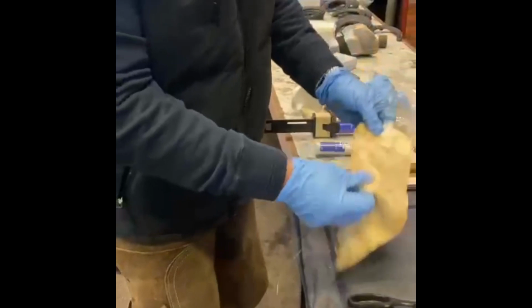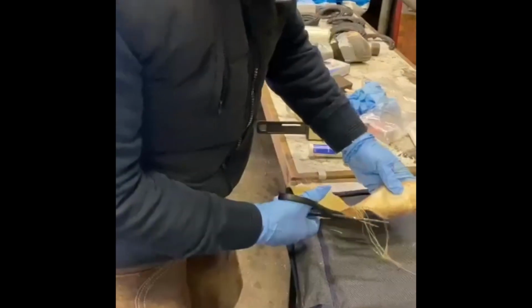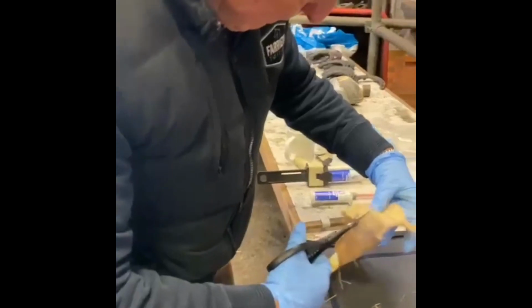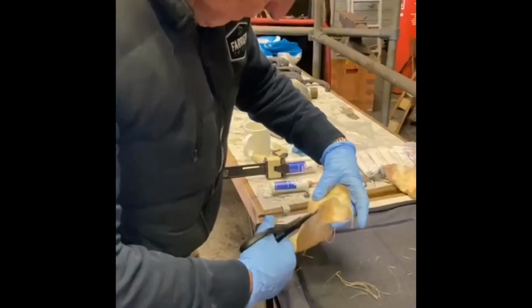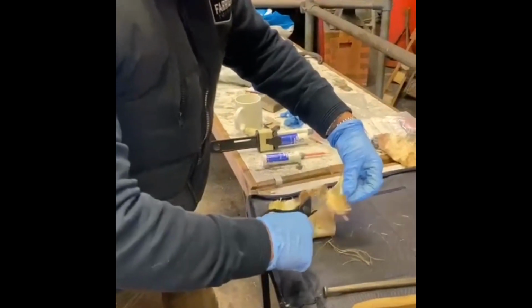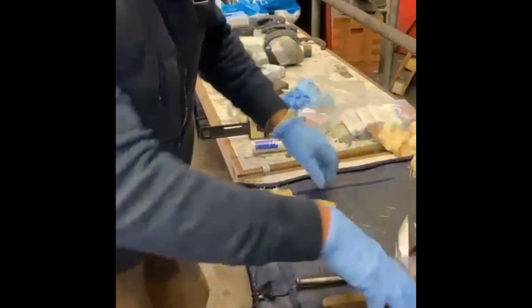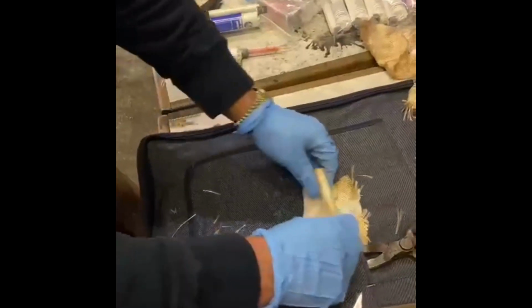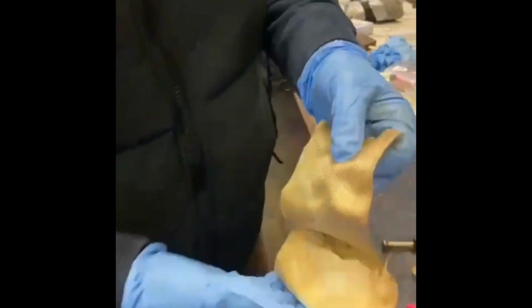So try it on the coronary band, wrap. Yeah, way too big. So I'm going to reduce it. Always easier to reduce it than to make it bigger. Obviously we shorten the length. Get rid of those little bits. There we go. Let's see again. 2, 3, 4. Right on our foot. That wraps in there, comes around the coronary band. That's about the right size. So we need to be relatively accurate for that.